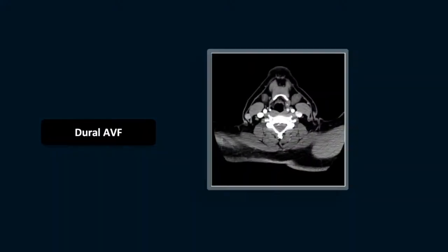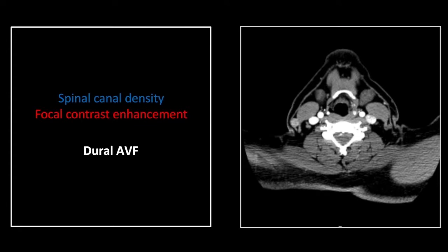Our next case is a dural arteriovenous fistula. This is also traumatic. You can see anteriorly there is increased density within the spinal canal. In addition, there is a small focus of increased density consistent with contrast, and you will see small veins both entering and exiting that region, consistent with an arteriovenous fistula.